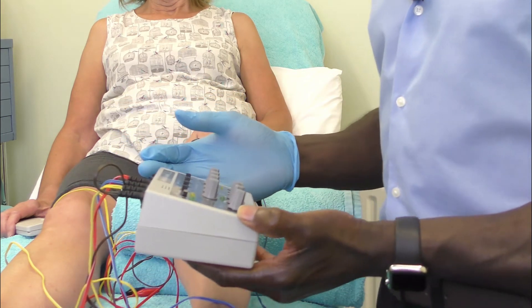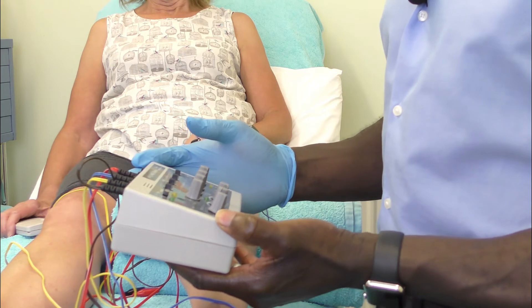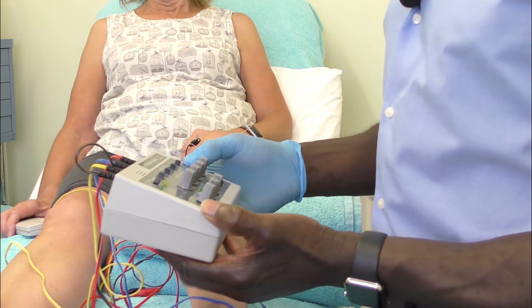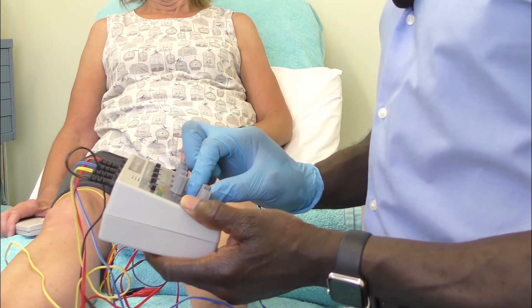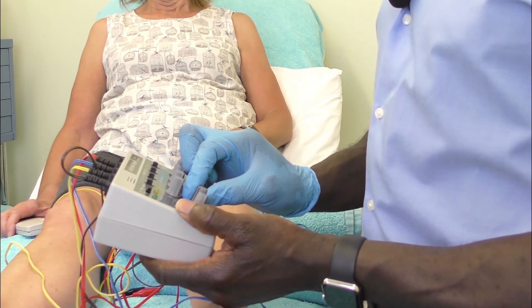You can set it to 2 hertz, which is primarily for pain management — many studies will set it to 2 hertz — but in this case I'm going to set it to 20 hertz, which I've found quite effective for treating osteoarthritic knees.